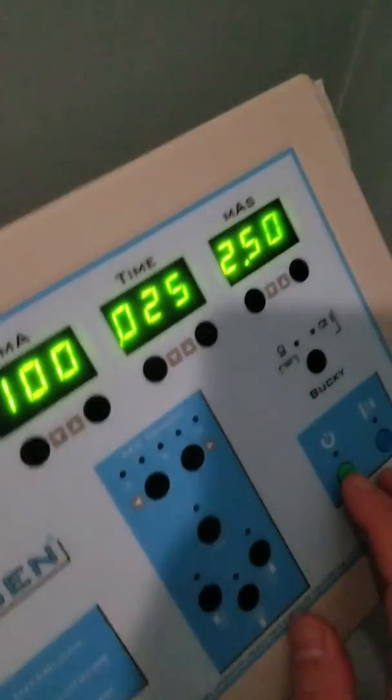Make sure the collimator is wide open, like it is, both in terms of width and height. Okay, so we're going to do our prep and expose.